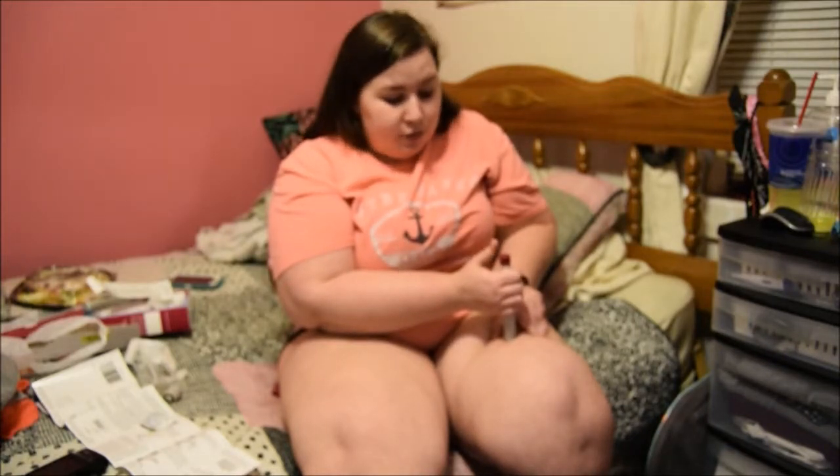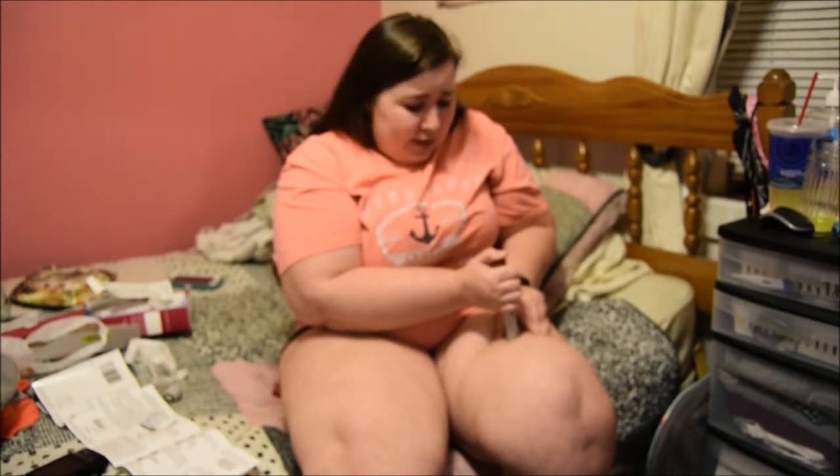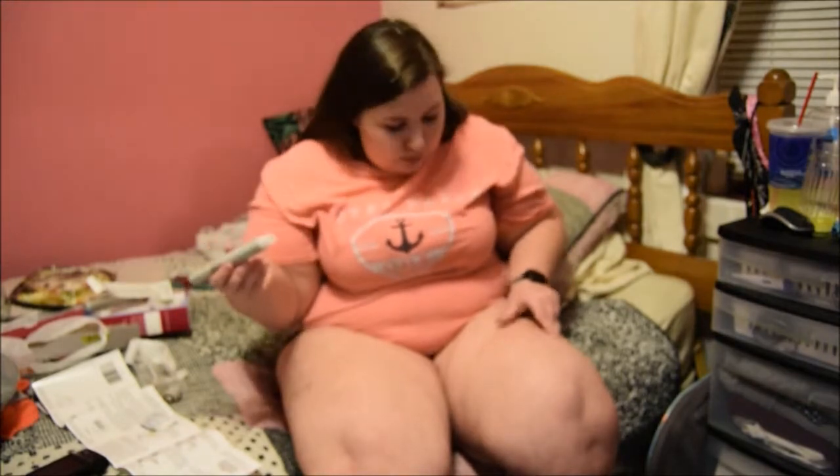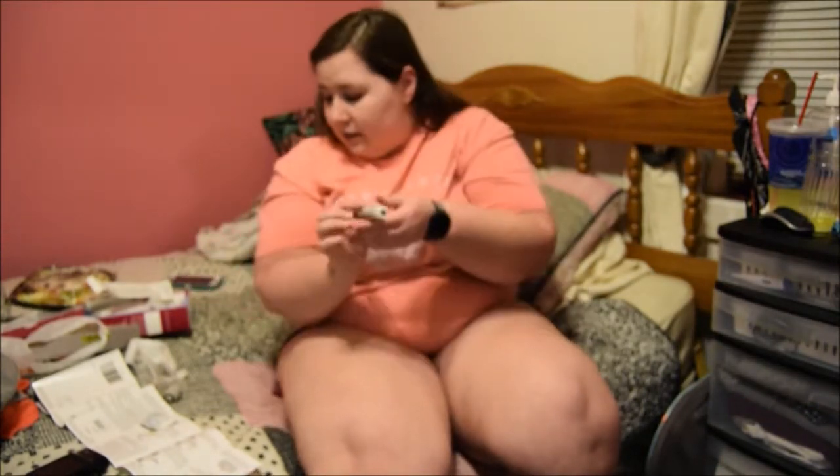1, 2, 3. I'm pressing now. Ow, ow, ow. 4, 5, 6, 7, 8, 9, 10, 11, 12. Ooh. And I counted to 12 because I count fast, so I add a couple extra seconds to it just in case. And yeah, so that one is done.